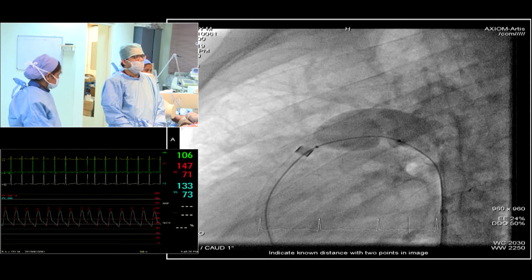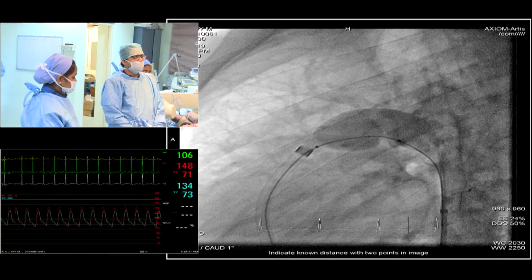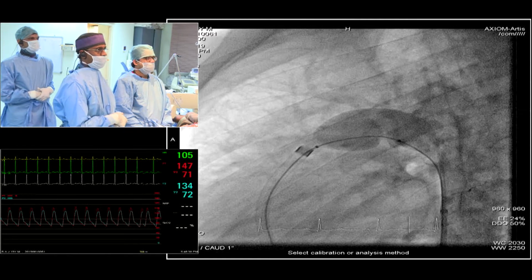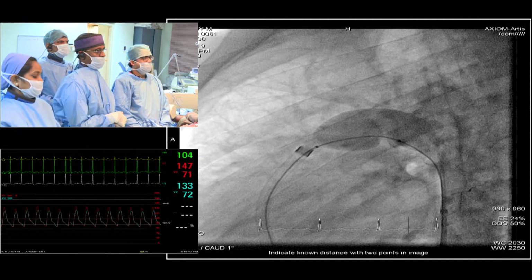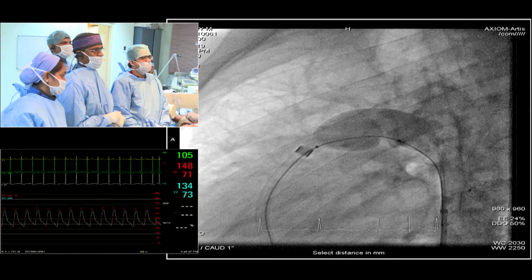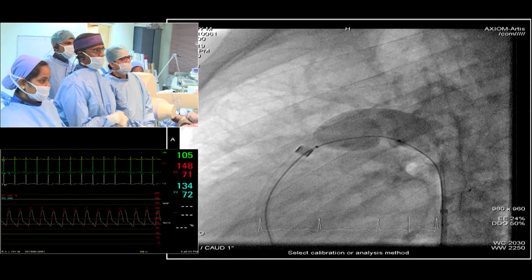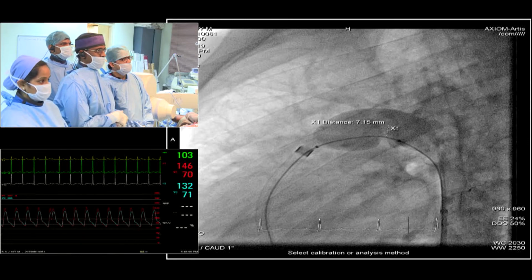So Jesse, tell us on this, where would you measure from and to? Exactly on the screen. How would you do it? Well, we have to decide what diameter device we want, and we also have to decide what length we want. So this picture helps us mostly to decide what diameter of the device we want. And there we're going to be measuring from the bottom of that unfolding, on the bottom curvature of the balloon. Come below that.